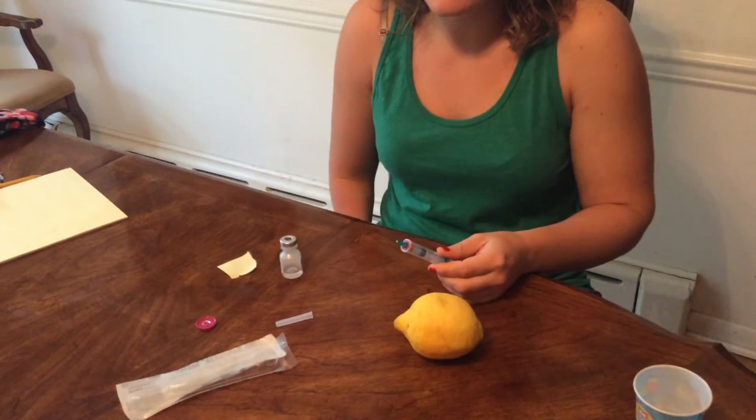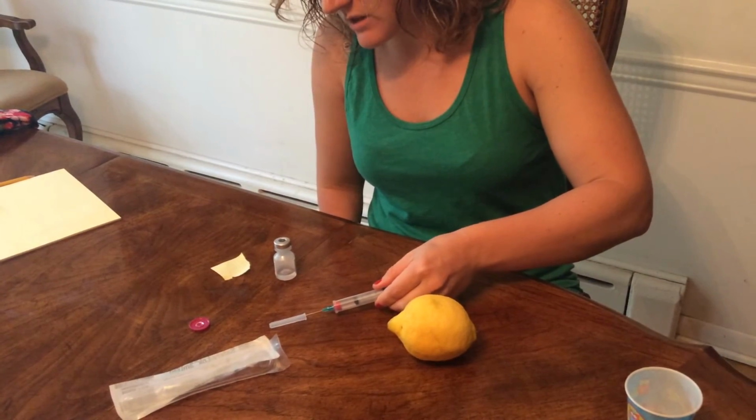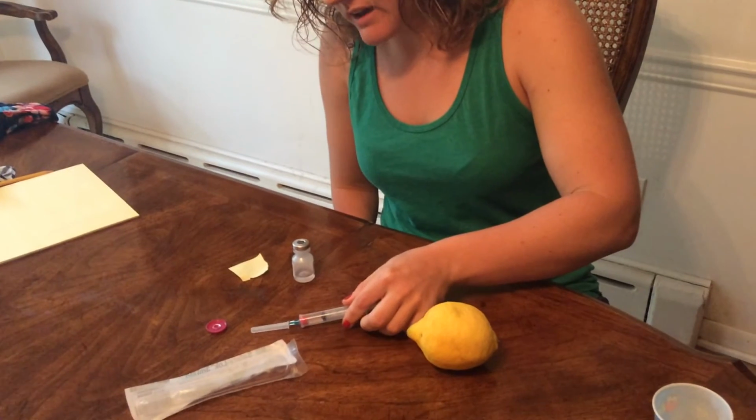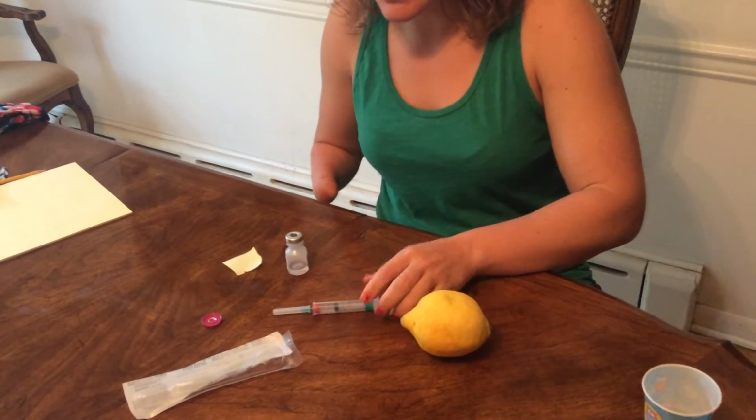Okay, so let's say you're getting this ready in the medication room first, or you're in the patient's room and then you need to get them ready. You just slide the bevel back in and just recap it for a second so you keep it sterile.